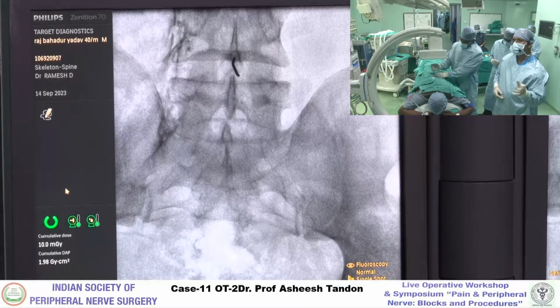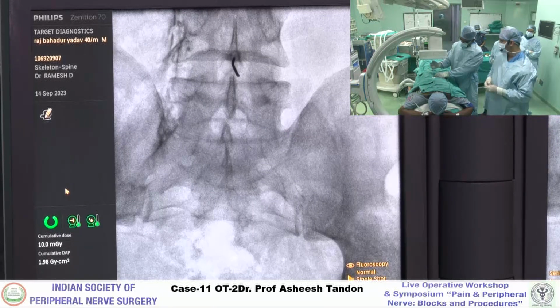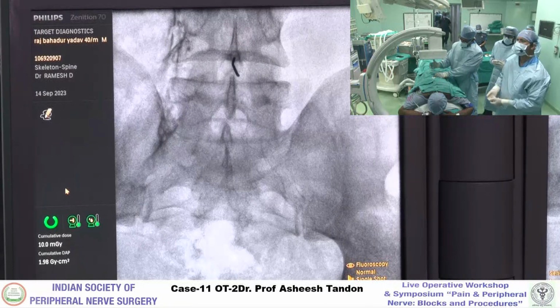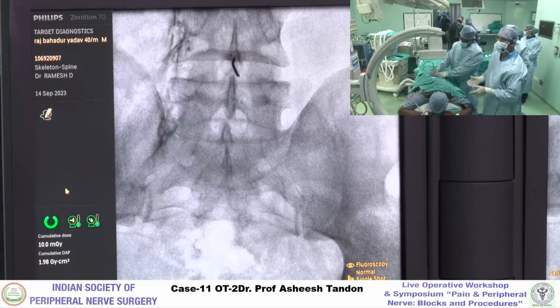Here, because of the interlaminar, if the window opens a bit with some amount of flexion, as we do for a discectomy, it's good. So you just put it on bolsters? No, not bolsters. Because the patient is conscious, at times bolsters can become a little uncomfortable, and you are not very worried about the venous congestion. So you just push in a pillow under the lower abdomen.